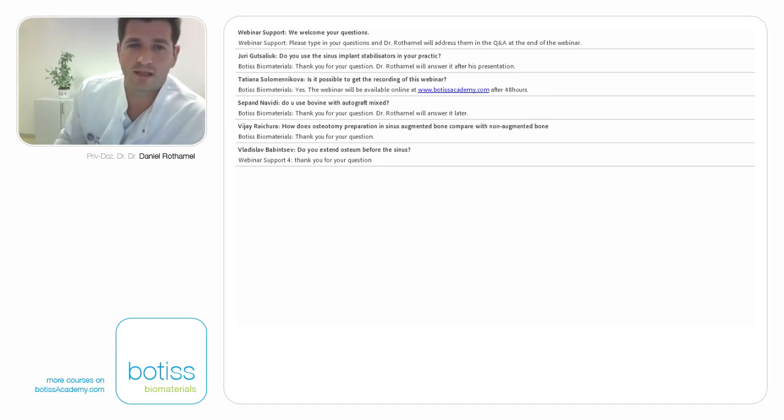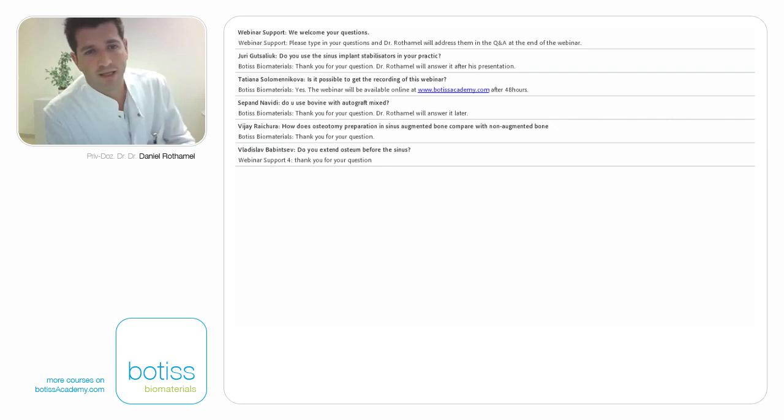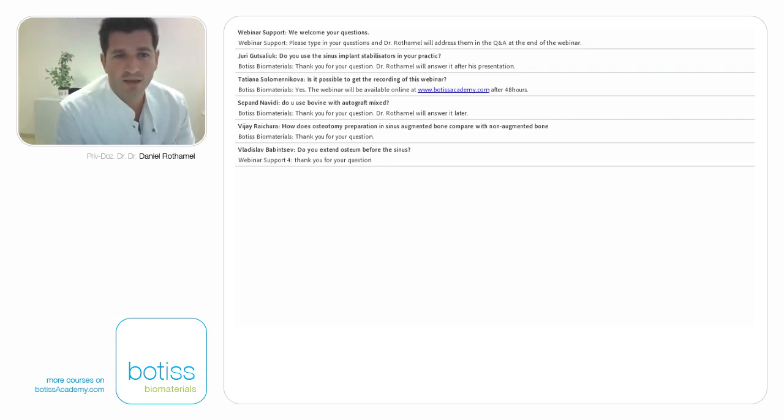What we know is that when we perform a normal sinus grafting procedure with the remaining bone height of about 2 millimeters, for example, then we can use the bone substitute material only. So the bovine bone is sometimes mixed in our clinic with some autograft, when we can just see that the facial aspect of the sinus is consisting of a very thick bone plate. Then we, of course, collect the bone material that we are removing when we are performing the lateral window approach, and then we mix it.